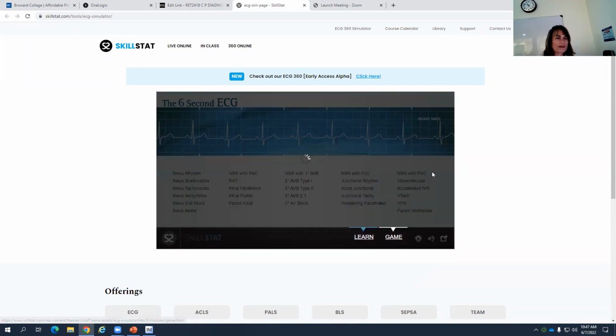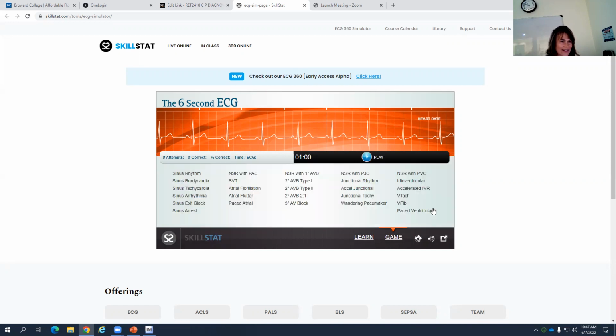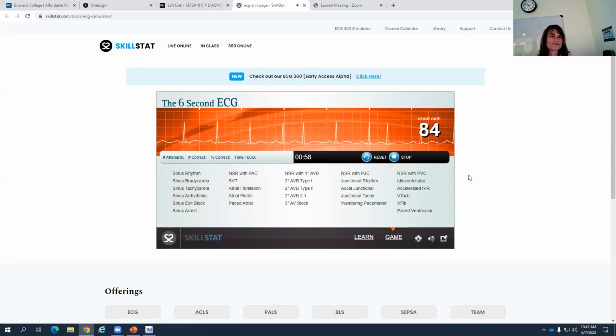All right, so let's play the game. Does it tell us how long we have? 1 minute. So everything looks normal, and then once in a while, there's one that's a little bit quicker. So this isn't one that we went through. Let's reset it.